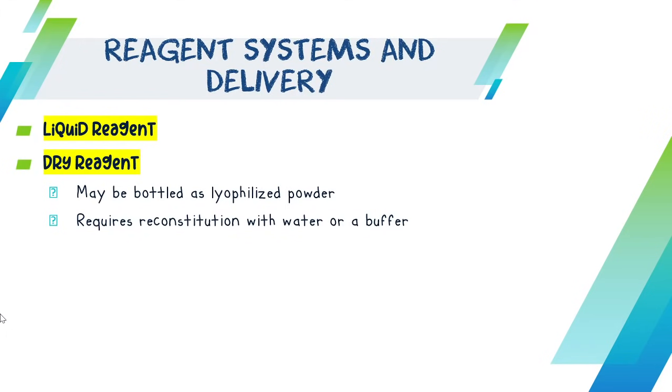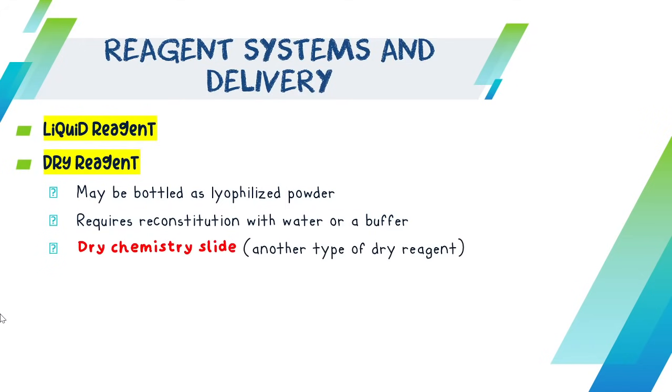If nag-face-to-face ta karon, if naa moy clinical chemistry laboratory, you could actually encounter this too. Naa tay mga liquid reagents na ready to use na diretso na lang dayon ninyo mix dito sa inyong sample. Naa pod ay mga reagents na dry na kung makita ninyo in powder form pa siya and you still need to place a water or buffer as mentioned here na para magamit ninyo siya. So again, dry reagent requires reconstitution.